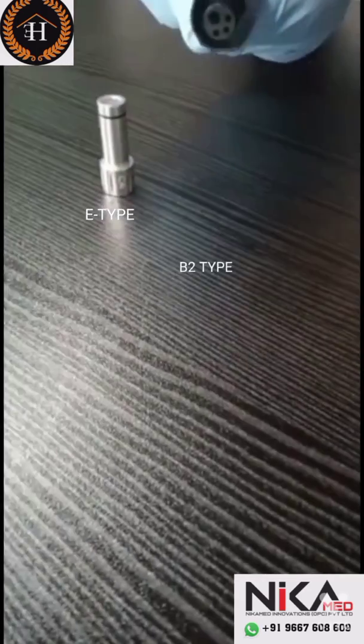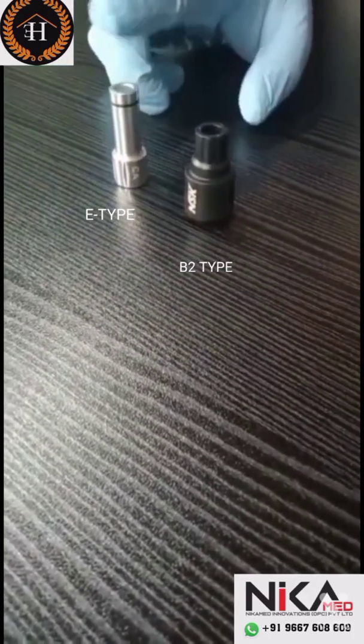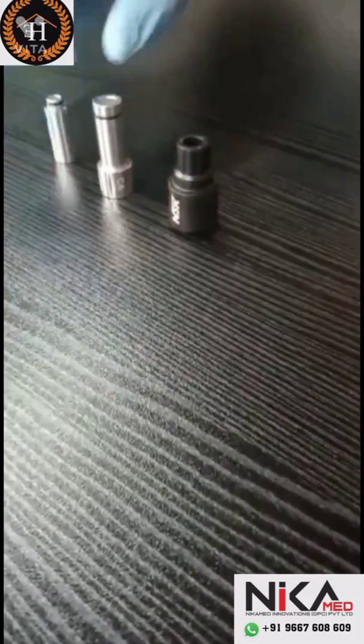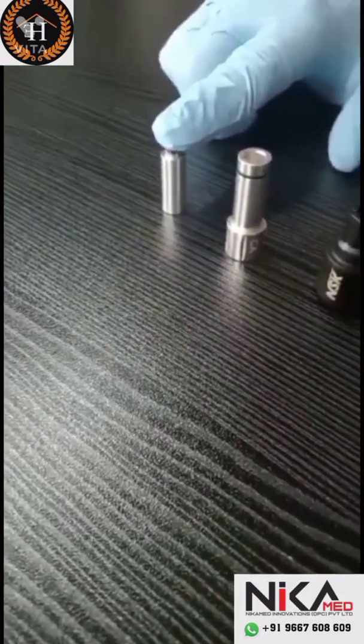One is for normal two-hole rotors. This one is for micromotor E-type handpieces like contra-angle, straight, and implant handpieces. And this is the F-type nozzle for endomotor handpieces.